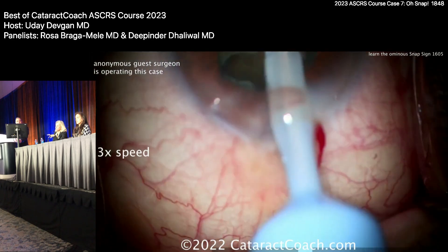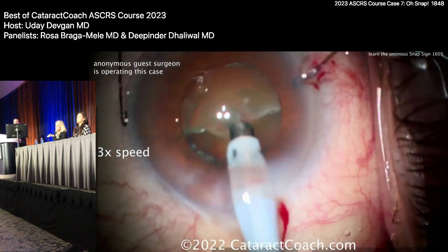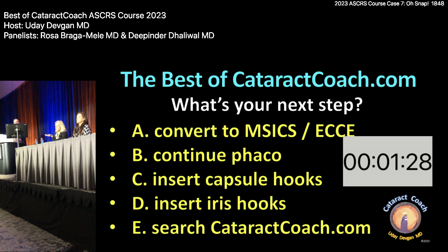I would stop at this point and not continue. I would inject viscoelastic — not only in the anterior chamber, but also behind this lens, almost like a visco-dissection — and pull all of this up into the AC. He's lucky it hasn't dropped back yet. Options include: convert to MSICS, continue phaco, insert capsule hooks, insert iris hooks — search cataractcoach.com. You want viscoelastic to bring the nucleus up above, then phaco in the AC with a visco scaffold blocking the pupil.